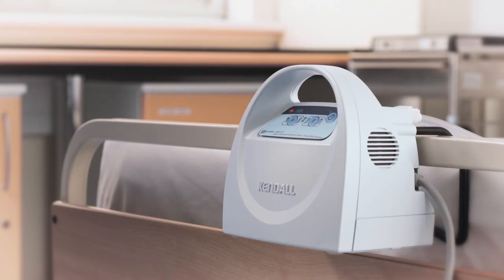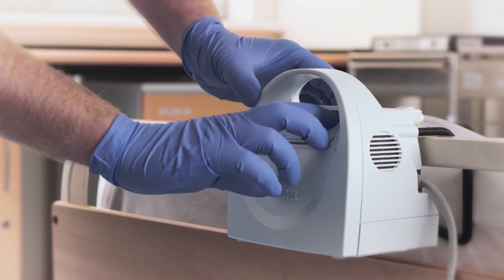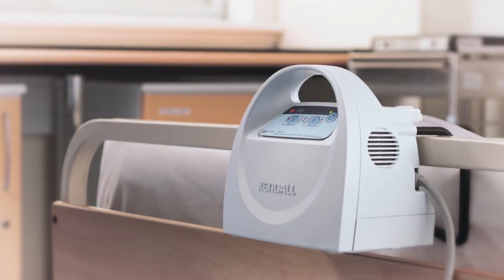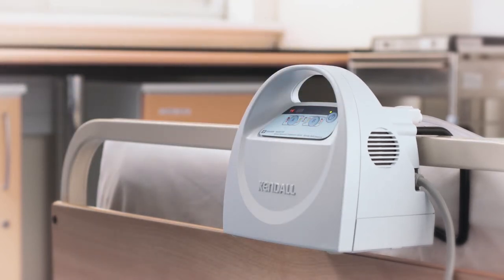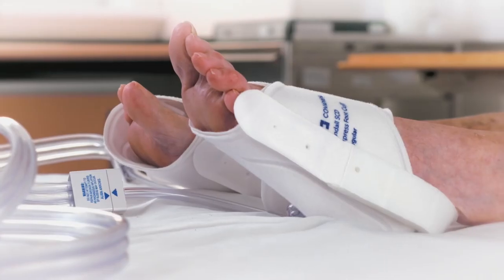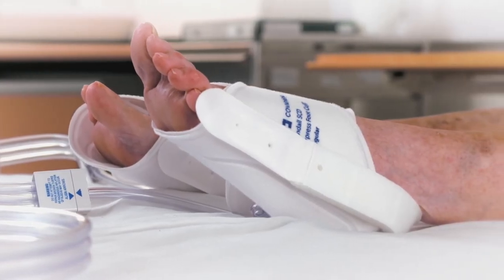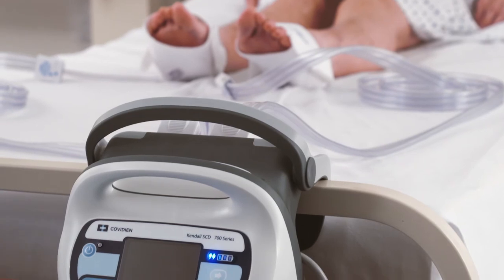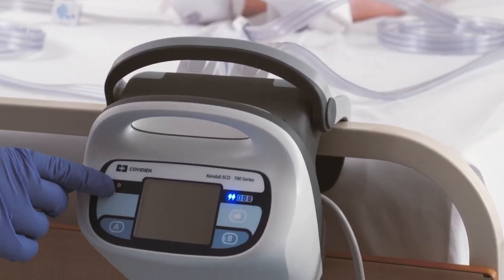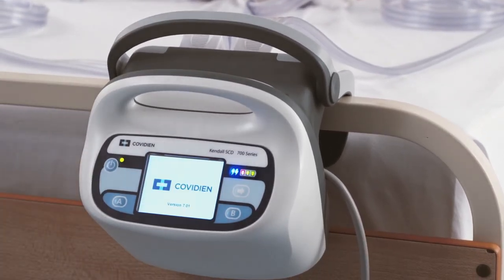The same one-touch start-up operation applies when using leg sleeves with the SCD Express controller. If a Kendall SCD Express foot cuff is being used, the user must indicate this during the garment verification procedure at the start of therapy.